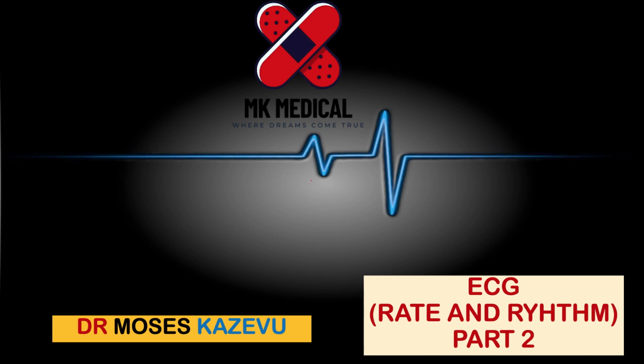In this particular video, we're going to be looking at part 2 of ECG interpretation. This is the ECG bootcamp. In this video, we're going to be looking at the rate and rhythm determination. So we'll pretty much introduce the steps that we're going to be undertaking when interpreting the ECG.